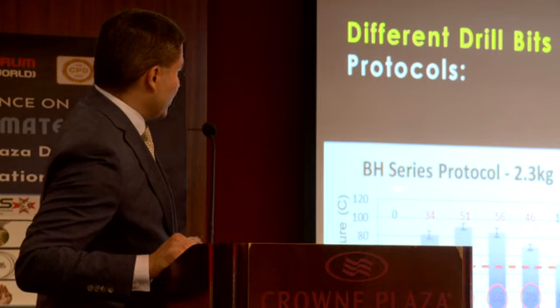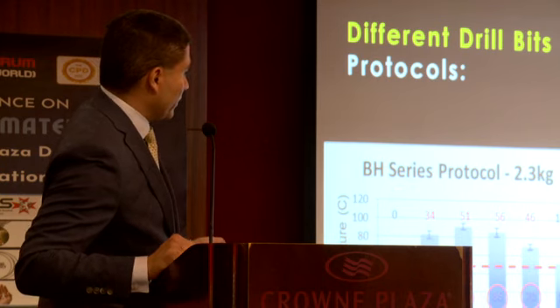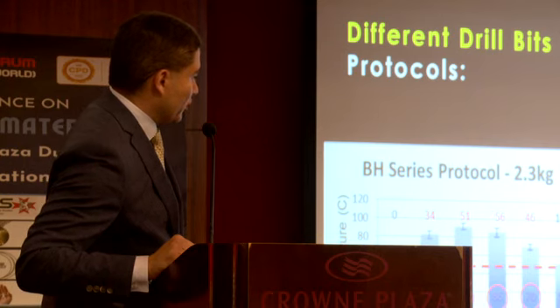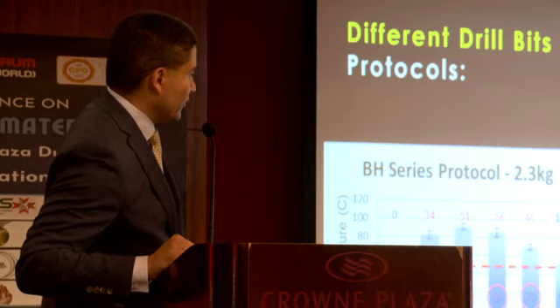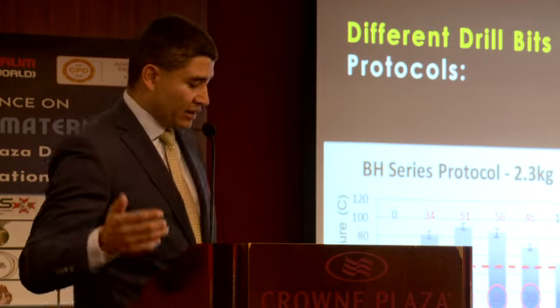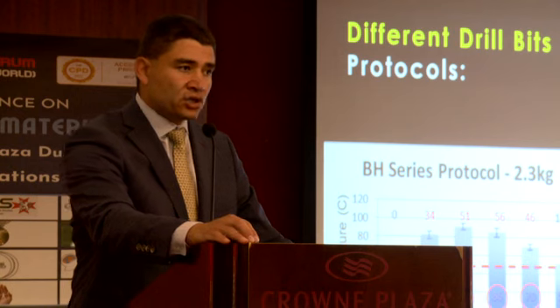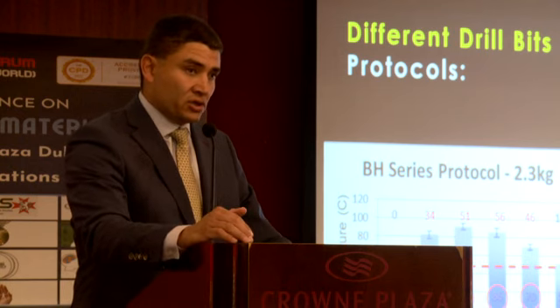This is one of the companies, this is another company, and different series, different results, but they're very similar, all above the threshold of cell death at different diameters and with different testing mechanisms that we used. Now, let me tell you that in research there are different levels of research, right?